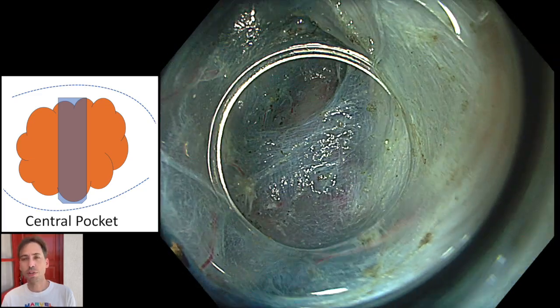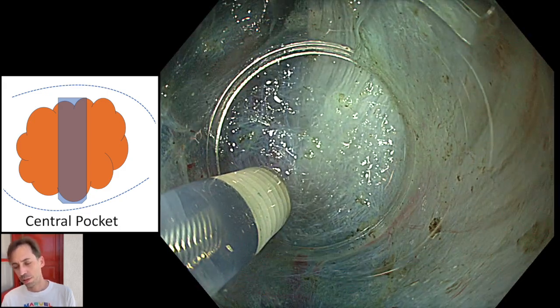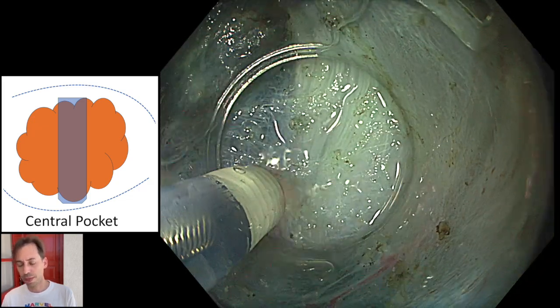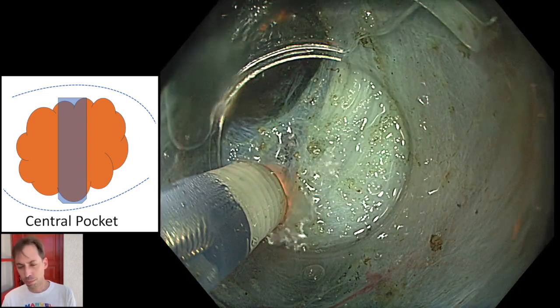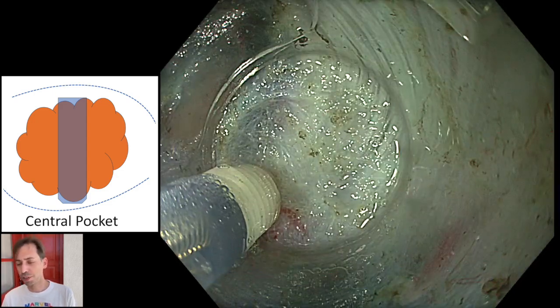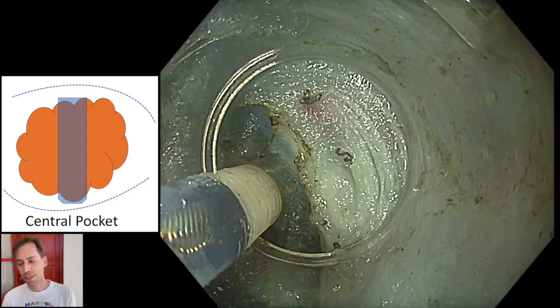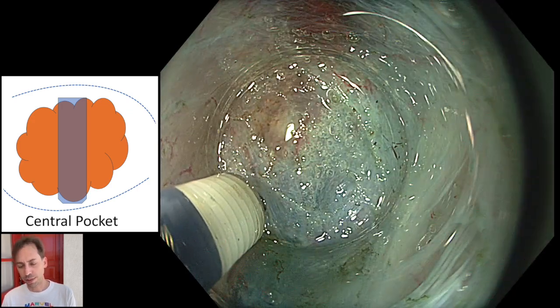Due to the size of the lesion, this patient has received general anesthesia in order to be calm, not painful, and not move. But some authors prefer simple sedation. So if I estimate that the procedure will last 1 hour, I use just propofol sedation. But this procedure, which lasted about 3 hours, I used general anesthesia.